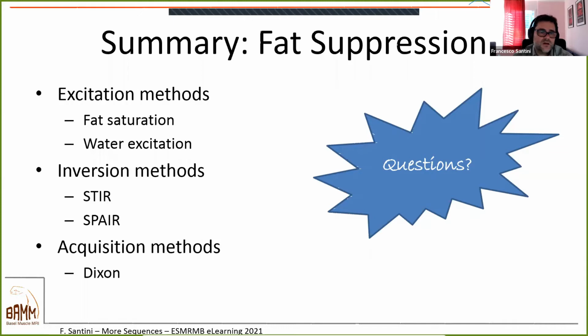You just activate the STIR sequence, and it's calculated for you. It's quite fixed, so you don't have to calculate the inversion time. We will see a bit later how we can calculate the T1 based on multiple inversions, which is the beginning of quantitative imaging.